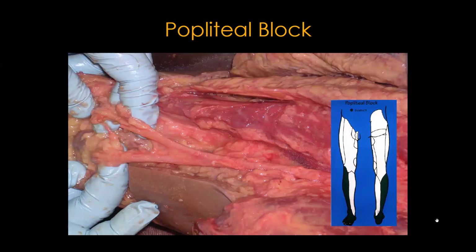All right, let's talk about the POP. So POP is probably the most common lower extremity block besides adductor that you'll be doing. And you can cause harm with this block. So you have to be careful. Like, no block is worth a lifetime of injury. Every single block you do, say to yourself, it's a never event. I cannot cause harm. I can't. Foot drop for life, chronic neuropathic pain, it can't happen. So you need to see that your needle is not inside the nerve. Like, that's the bottom line.